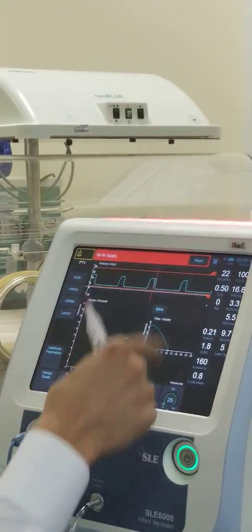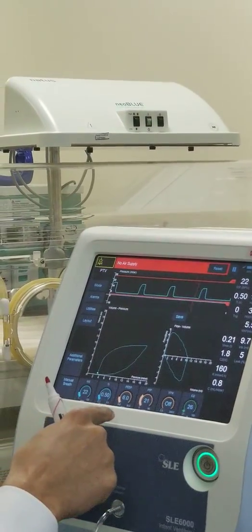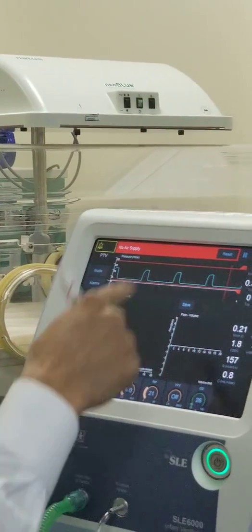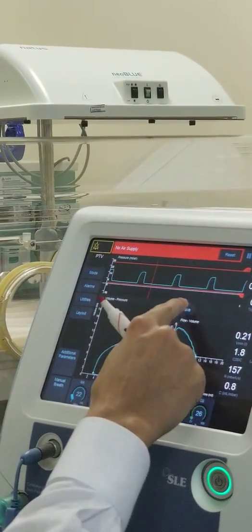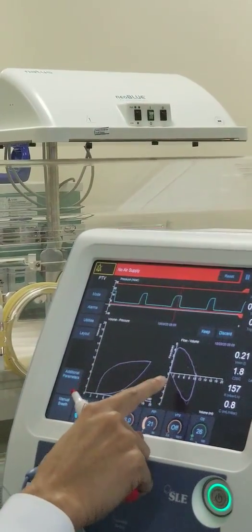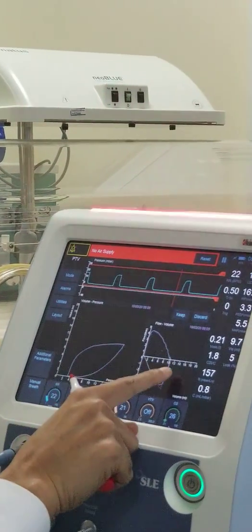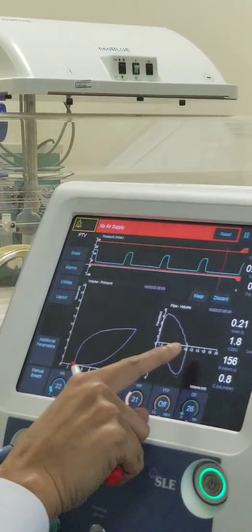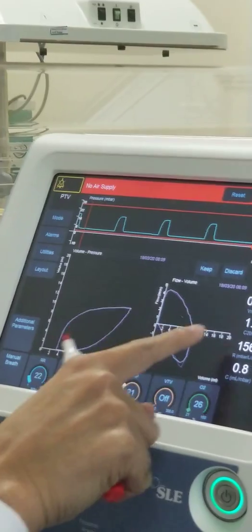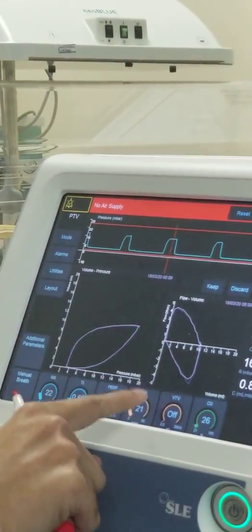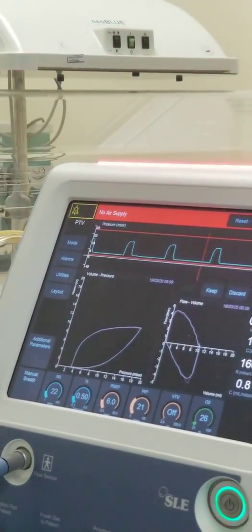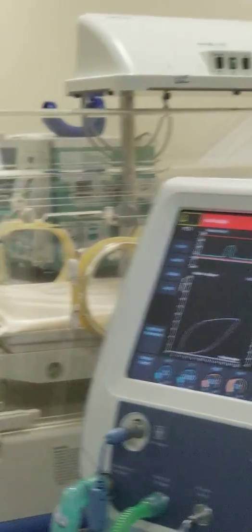If we look at the ventilator display, you can see it is both inspiratory and expiratory. The zero starts here, the volume is around 10 mL, and the flow is shown as positive or negative. This is one of the important differences between the volume-flow loops in the ventilator versus pulmonary function.